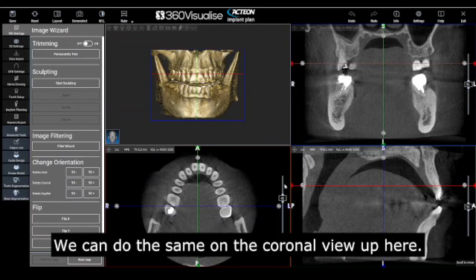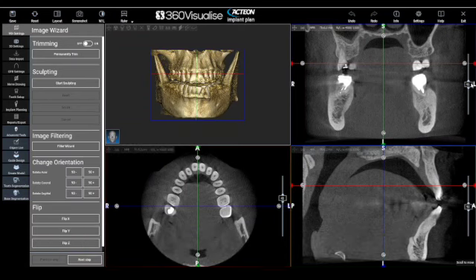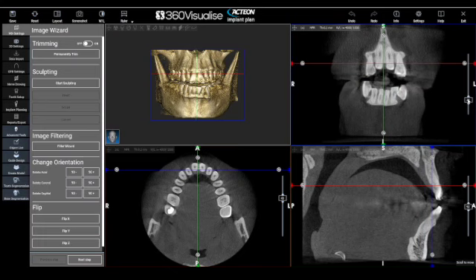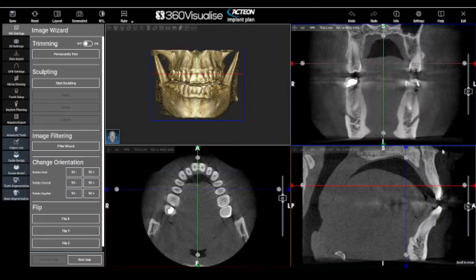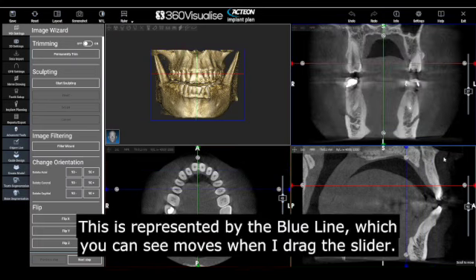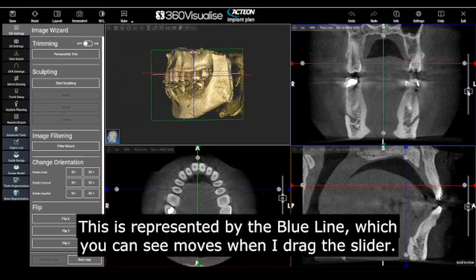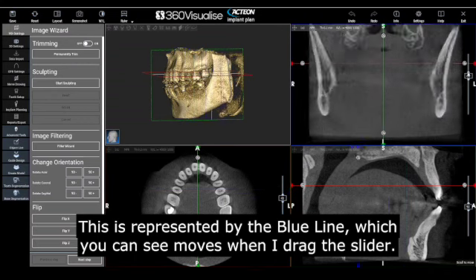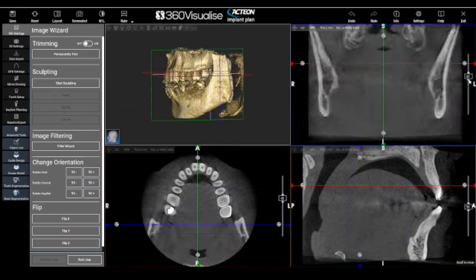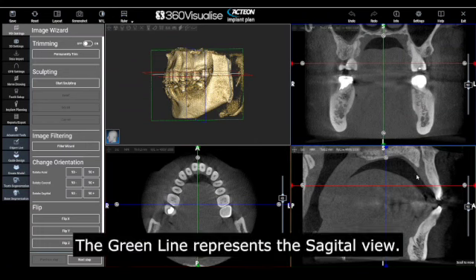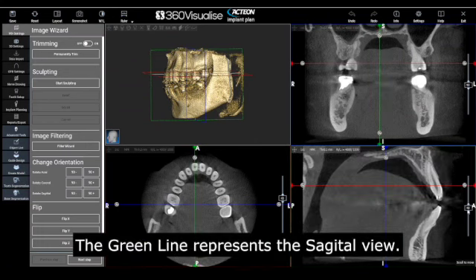We can do the same on the coronal view up here. This is represented by the blue line, which you can see moves when I drag the slider. The green line represents the sagittal view.